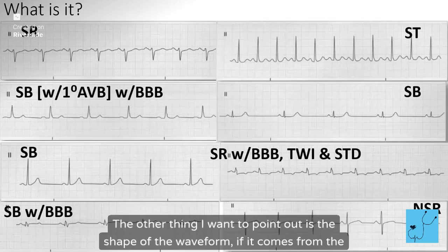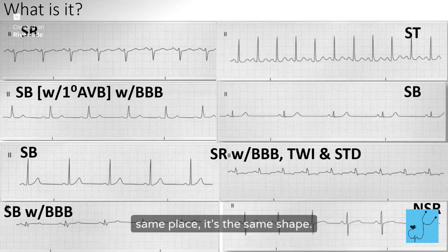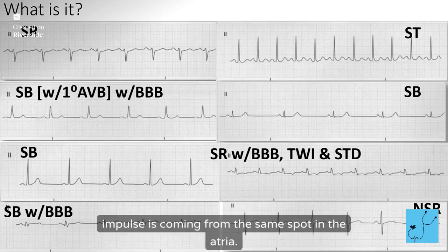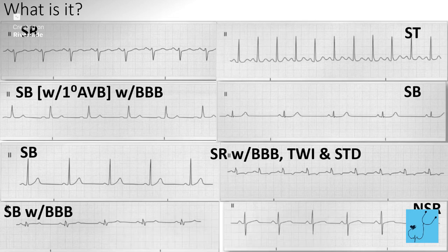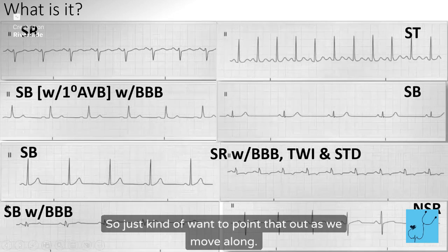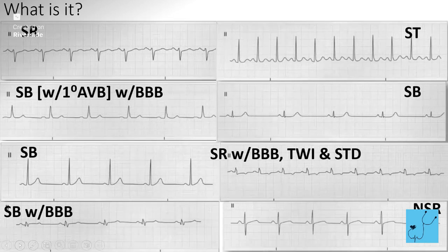The other thing I want to point out is the shape of the waveform. If it comes from the same place, it's the same shape. So if I have a P wave and it always looks like it's the same shape, then that impulse is coming from the same spot in the atria. Why that's important, if you have PVCs or PACs, the shape matters, right? So I just kind of want to point that out as we move along.